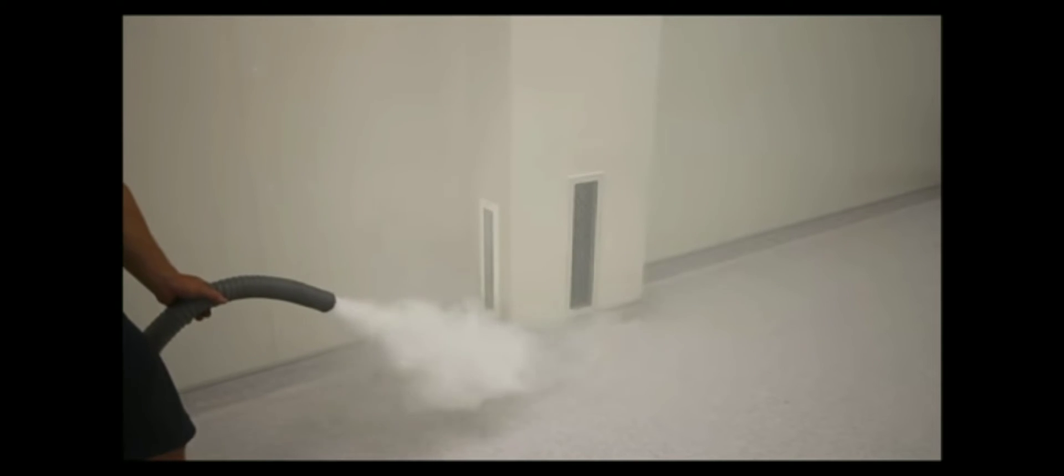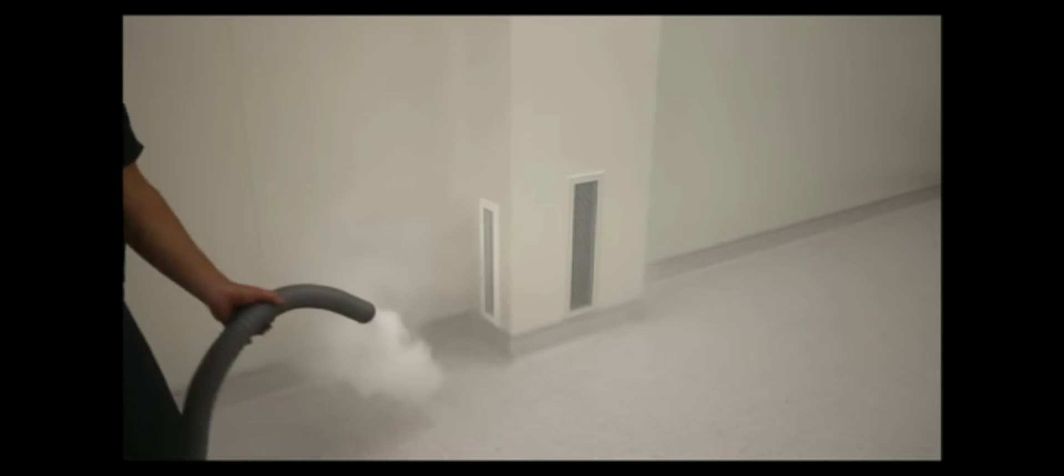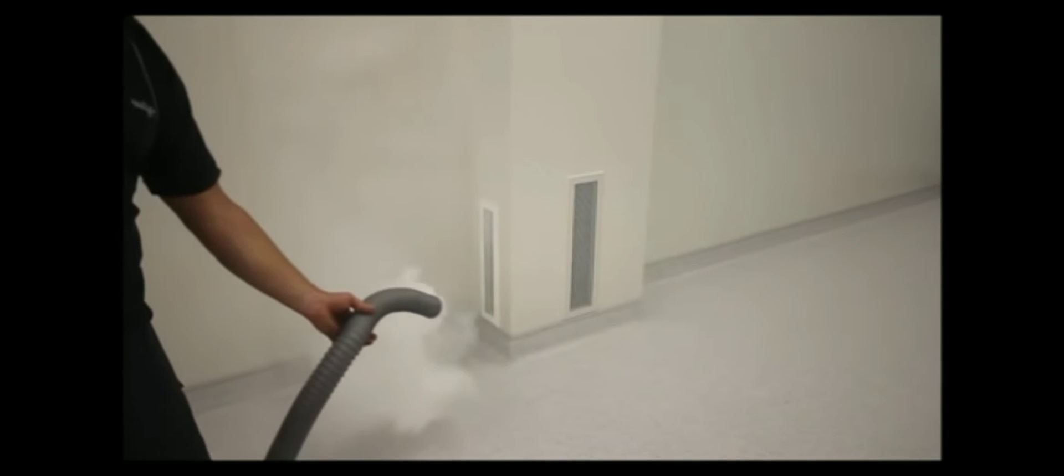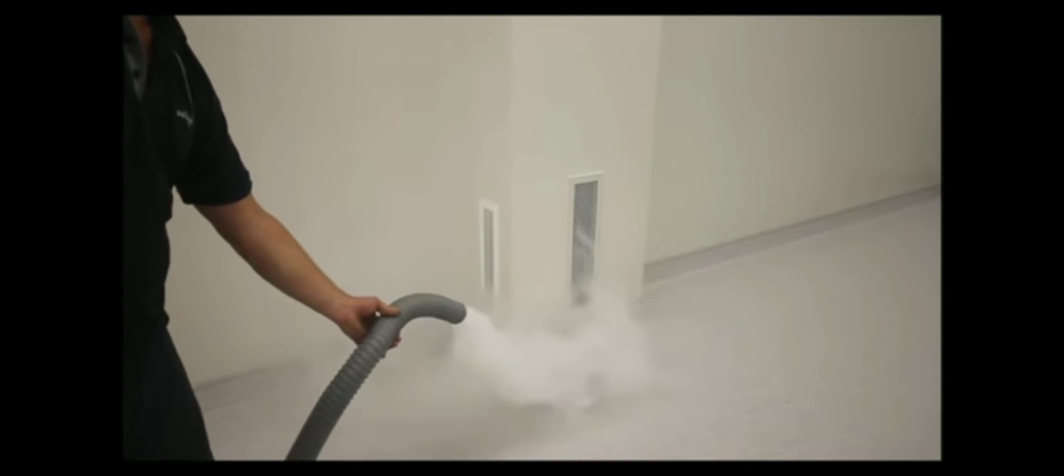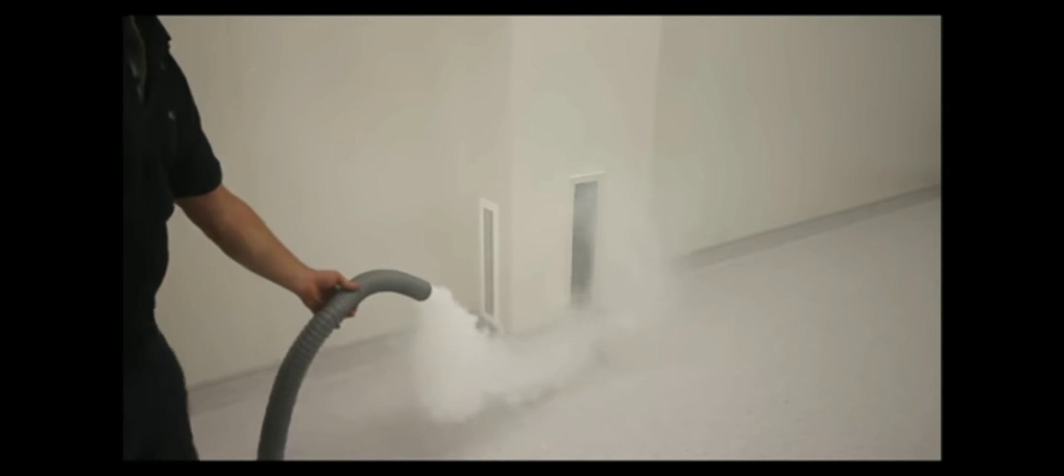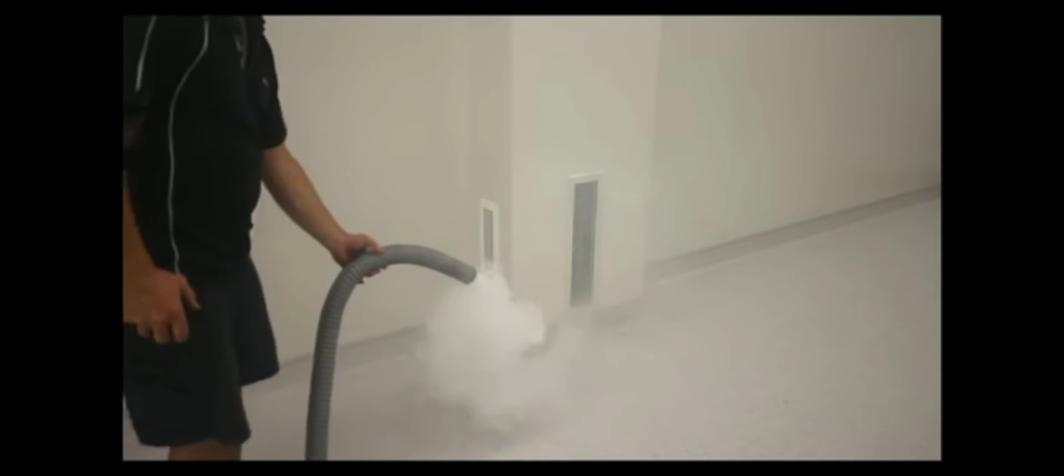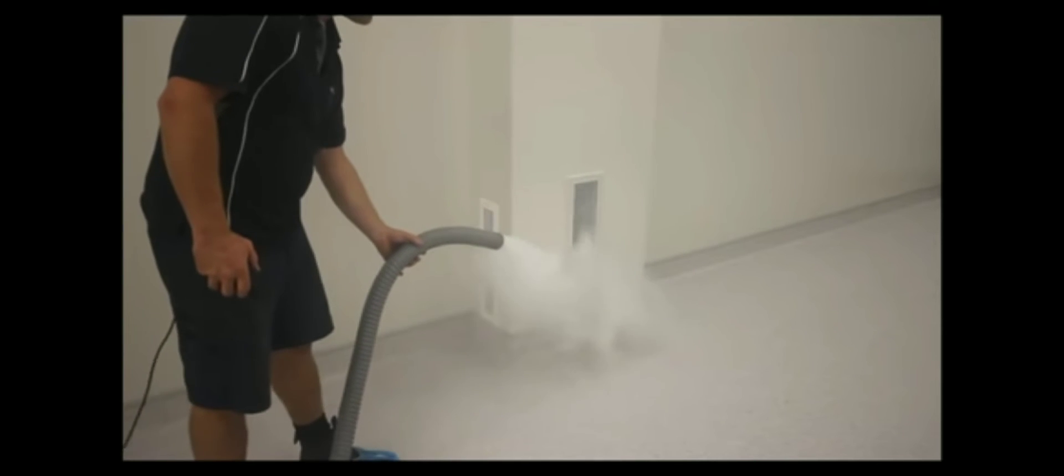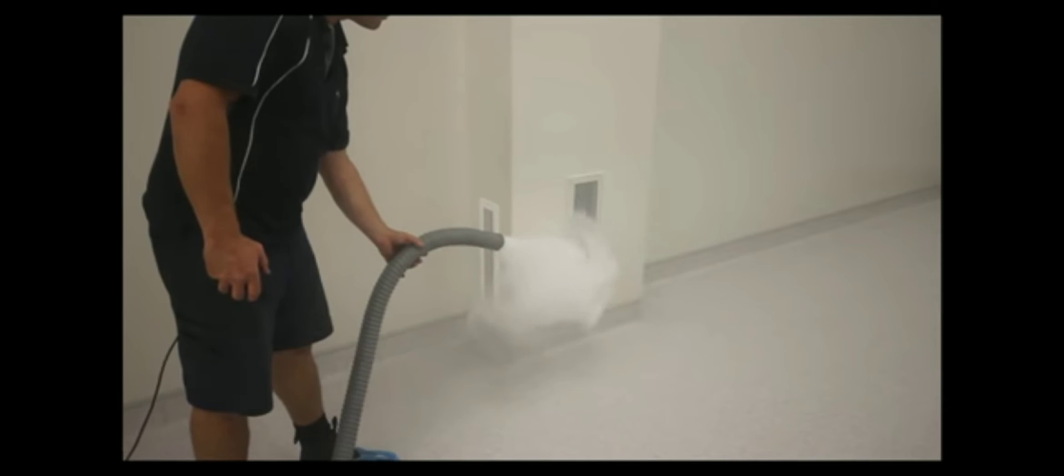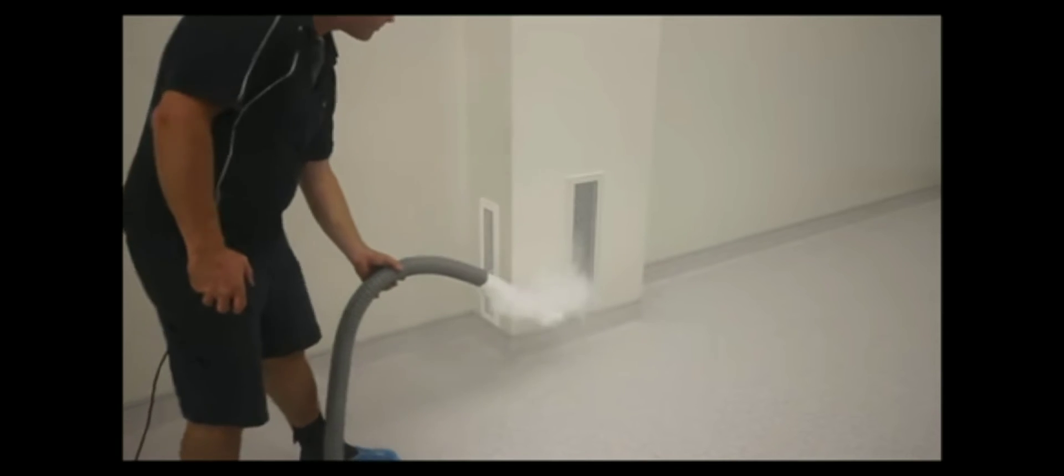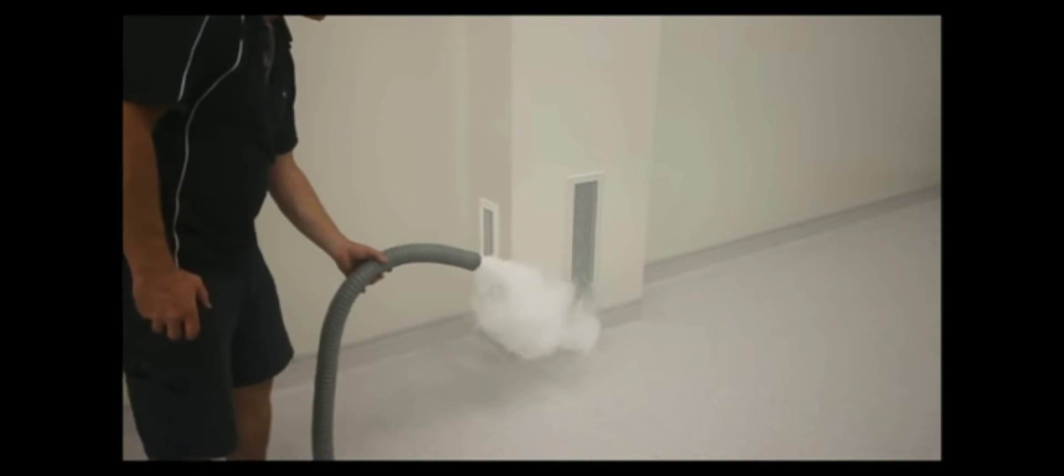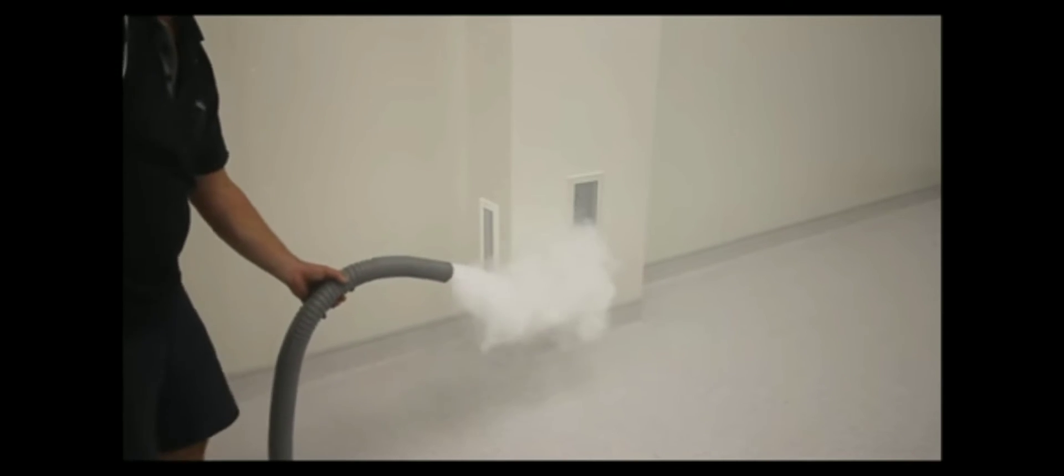If you don't get a take within one or two shots, if it is a mixed flow area the smoke will disseminate across the clean room and you won't be able to get the shot very well. The idea there is that you wait for the recovery of the room and once the room is recovered you then take the shot.